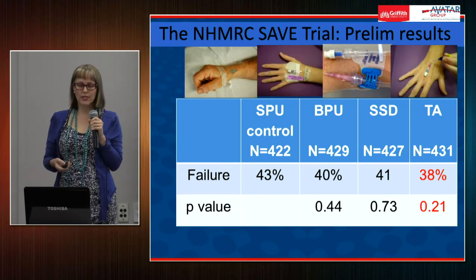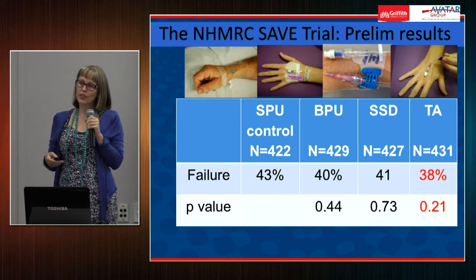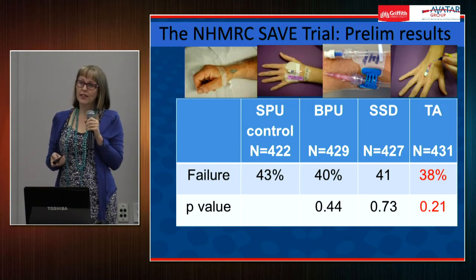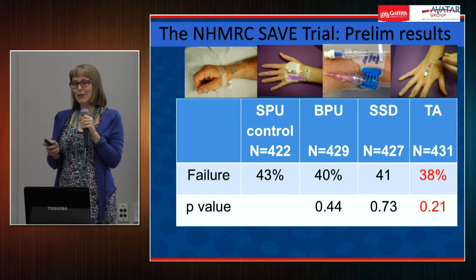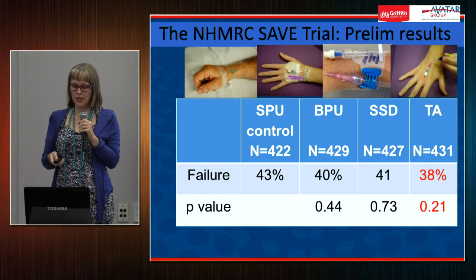So we're trying to dig through this data at the moment, and it does look like there is some suggestion that it is the use of all the extra things that makes the difference, not so much what the base product is. So I think a lot of those historical things that we've never tested, the tubey grip kind of things, the little stockinette kind of adjustments, perhaps we should look at that instead of just using Micropore by the 8 kilometres of it per patient. Maybe we should stop and study that and work out how much, how often, or should we be using a better quality tape perhaps? I don't know.